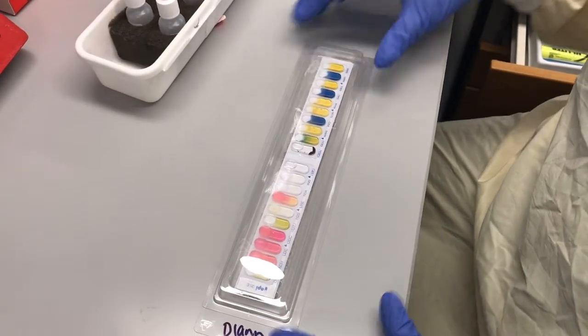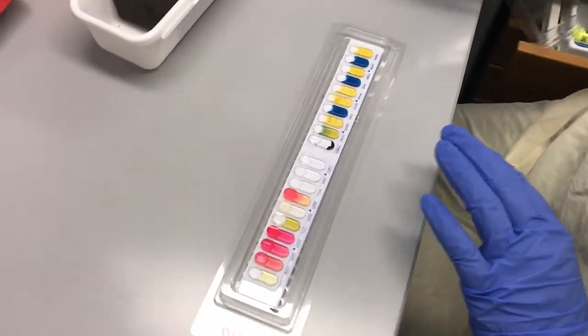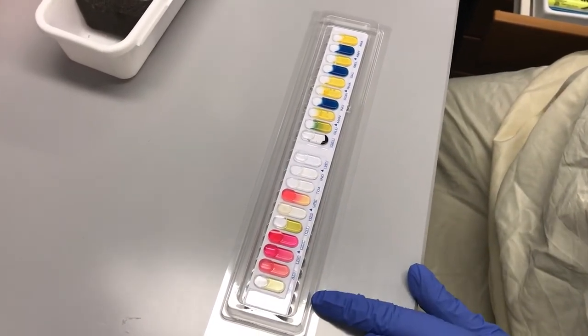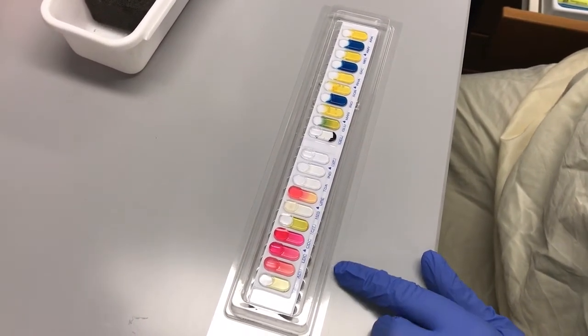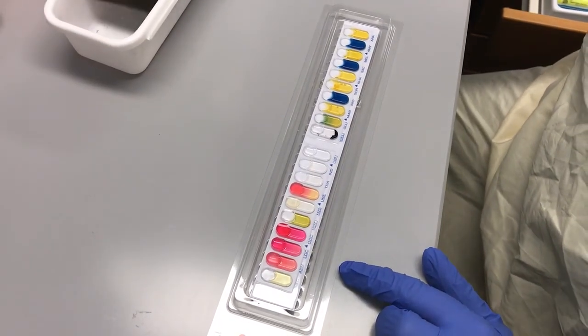You've checked your purity plate and it's fine, and you've incubated everything overnight. Take the lid off — once you take the lid off you never put it back on until you're ready to throw the whole thing away. As you can see there have been some color changes — some pinks and some yellows. You have to have at least three visible color changes in order for the test to be valid.